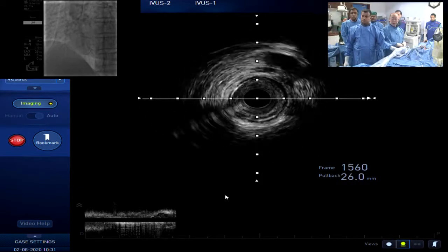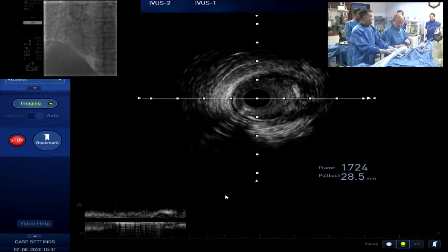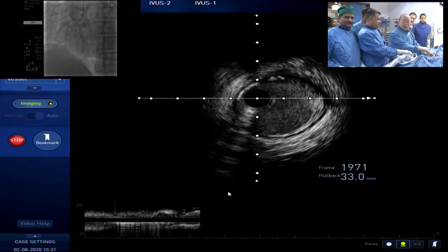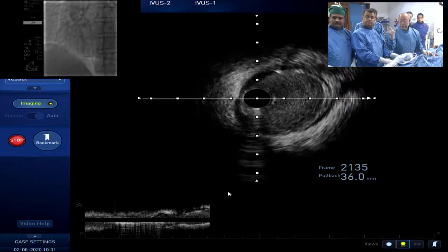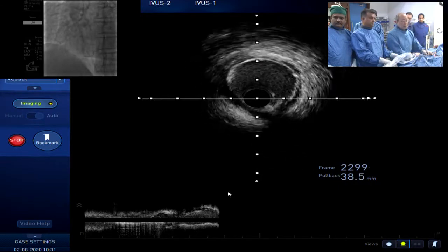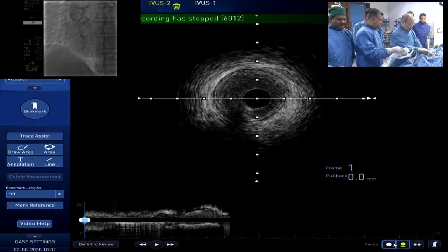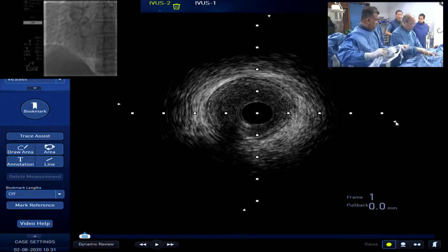Dr. Saito, are you surprised? No, I'm not surprised. But from the angio, it looks like your wires are outside first and then go in. So from the IVUS, we need to review a little bit. The vessel size is 3.5. So the calcium is not much, right? Not so much. There's only one nodule of calcium that you could see, so I don't think a rotablator would probably add much value in this case. No, not useful.